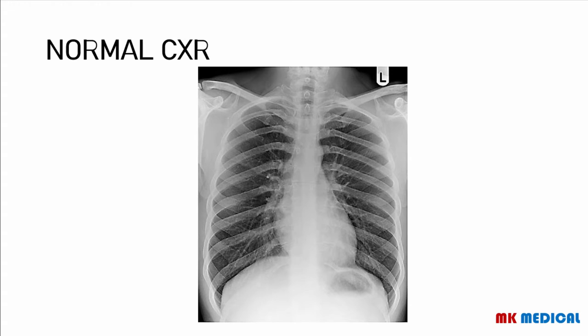We then go on to the ABC approach, looking at the airway and each of the bones on the X-ray. We looked at some pathologies present on bones, like fractures, scoliosis, kyphosis, rib sclerosis, osteolytic lesions, as well as other bone pathologies such as rib notching.